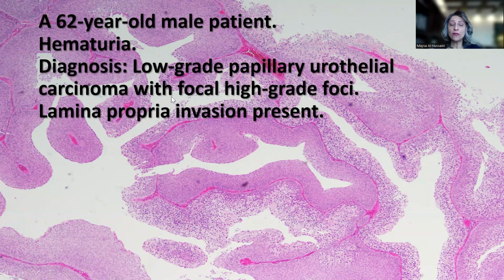And of course, we have to comment on lamina propria invasion because this would really alert the physician to examine further and perhaps to go again with cystoscopy and to sample the area, making sure to include muscularis propria. Muscularis propria was not included in this specimen.